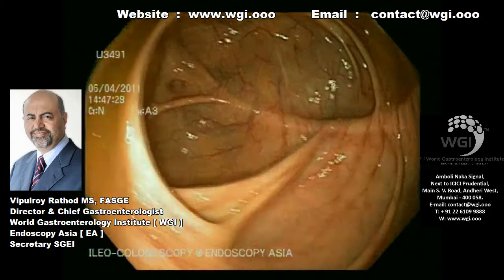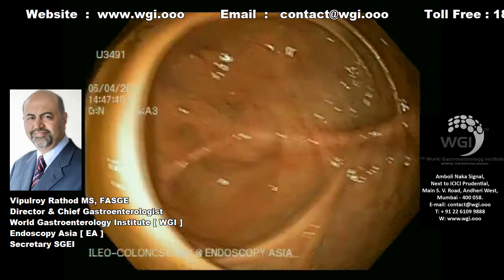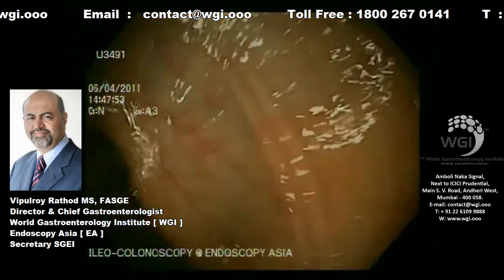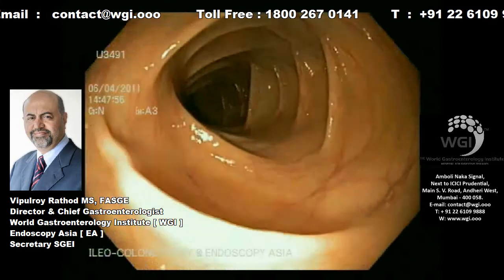We are holding the shaft of the scope in the right hand. Very gentle maneuvers with the shaft of the scope and the up-and-down wheel — the big wheel — on the left hand, and very gentle withdrawal of the scope.